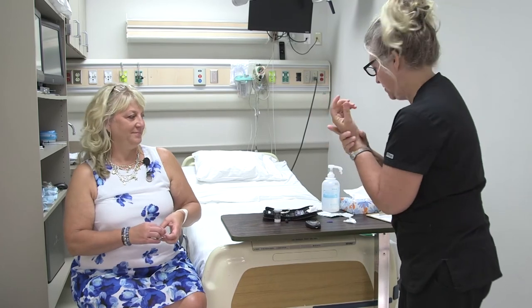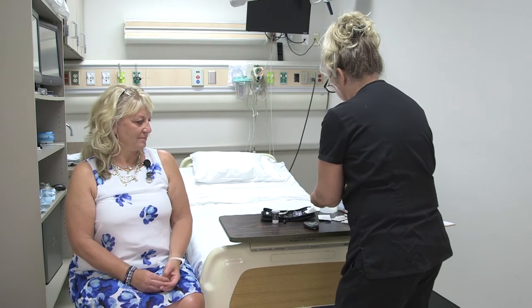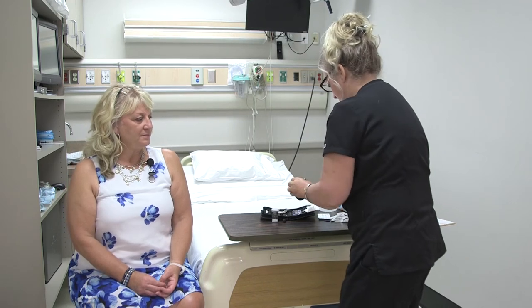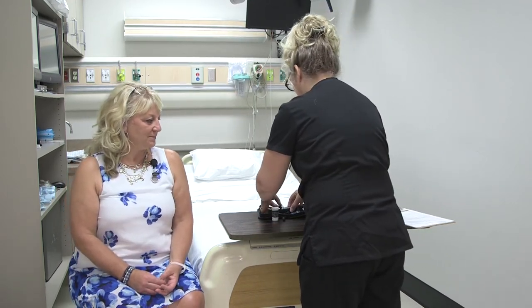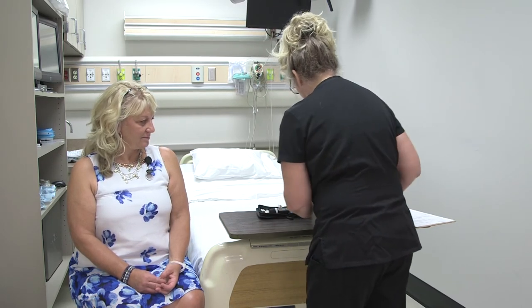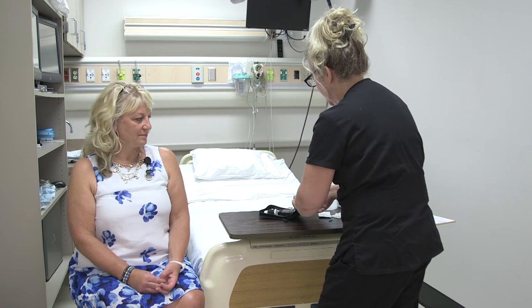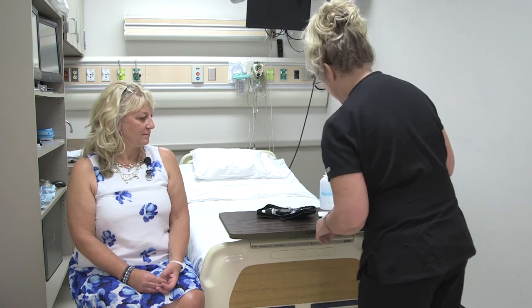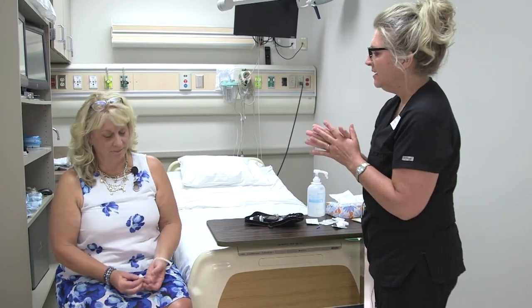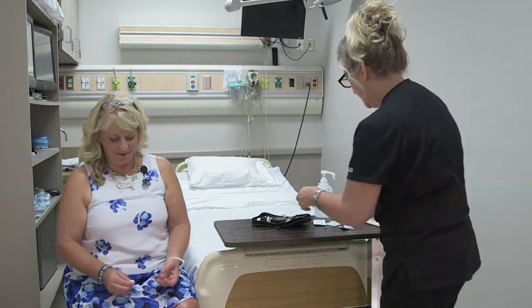That's right within the normal range — very good. I'm just going to do a quick clean of my equipment. Do you have any questions for me, Sylvia? No, I'll ask the doctors. Okay, that sounds really good. And if Sylvia were in the bed, we would make sure the bed was locked and lowered, the call light was within reach, and that she had everything she needed. So if you need anything, let me know. Thank you!